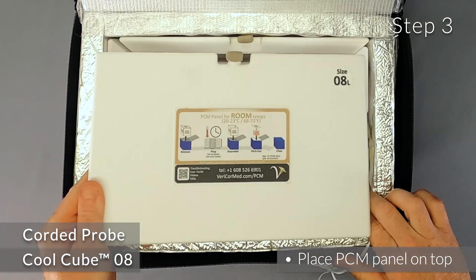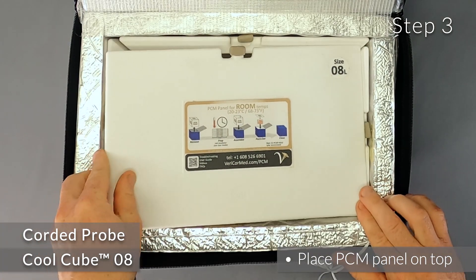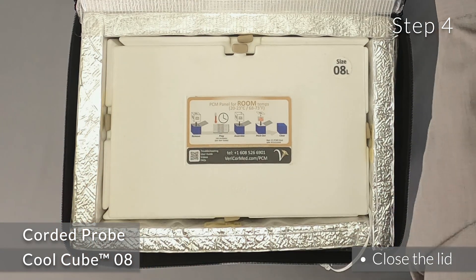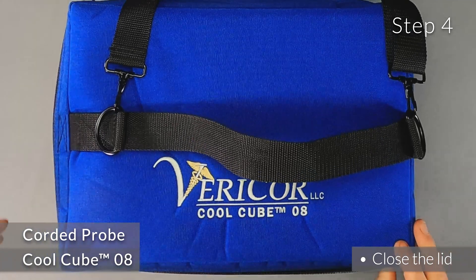Step 3: Place the last PCM panel on top to complete the chamber. Step 4: Close the lid of the CoolCube.